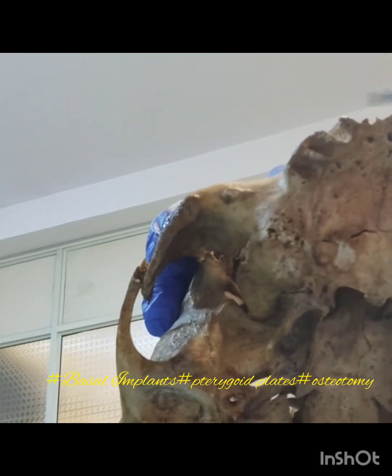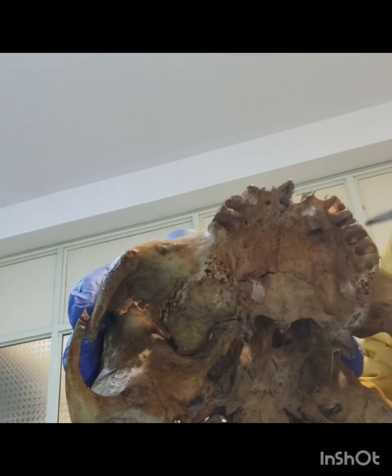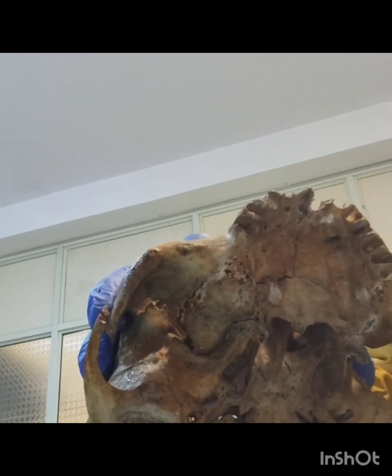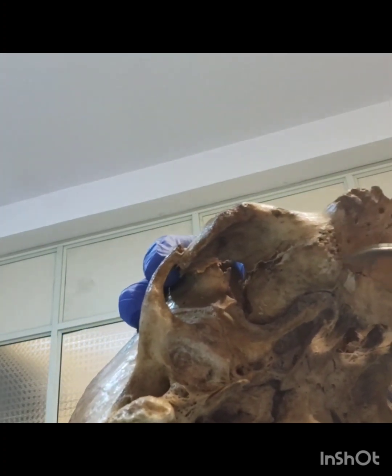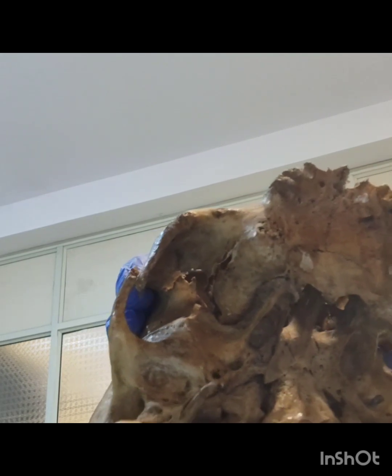So this is the maxilla. You can see the maxilla, edentulous maxilla. You can see the sockets of all the teeth. Beyond the second molar area, can you see the tuberosity here? This is the tuberosity area on both the sides.